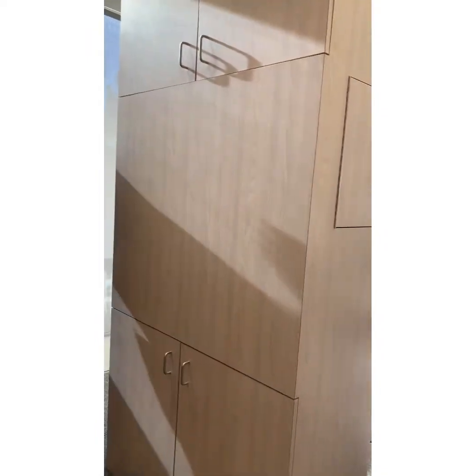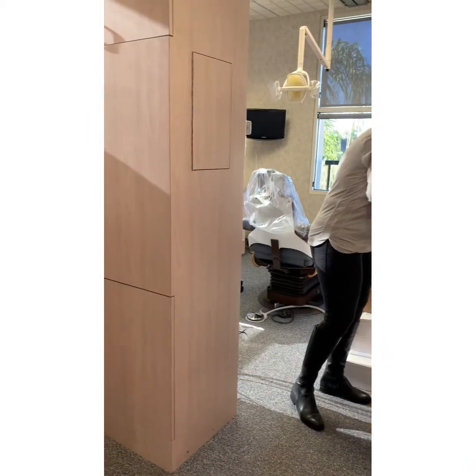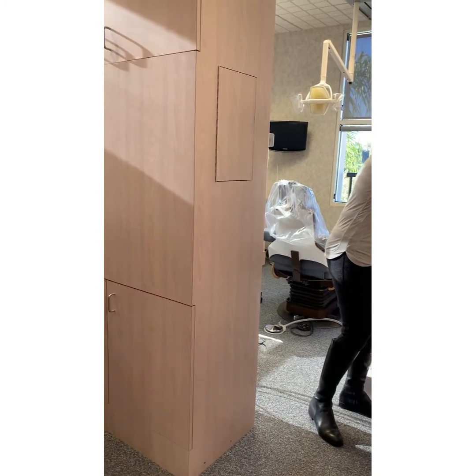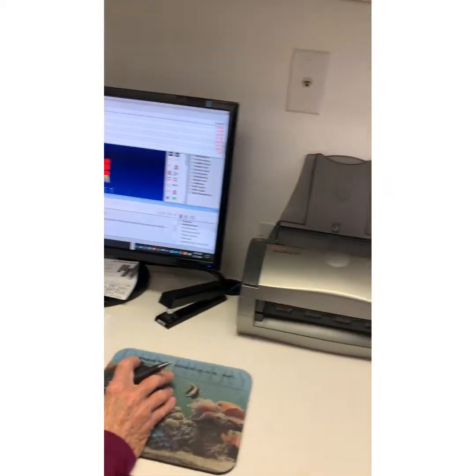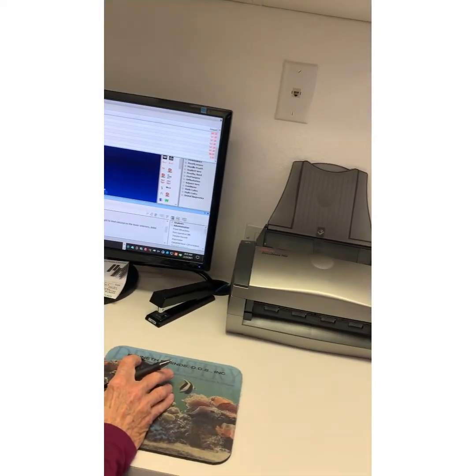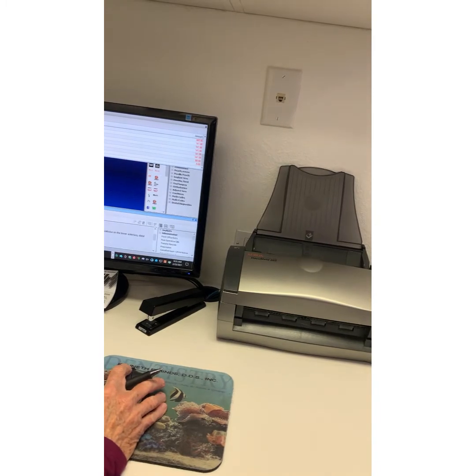Pam, this is Dr. Anderson. Hi, how are you? Great. Welcome to our new machine. You've been to the office, but welcome to the new machine. This is great. Looks like it's 2, 3, and 18. No, she said lower right. Well, there's other stuff too here. Teeth needing treatment: 18 crown, but 2 and 3 first. Future implant lower right. Okay, LR.